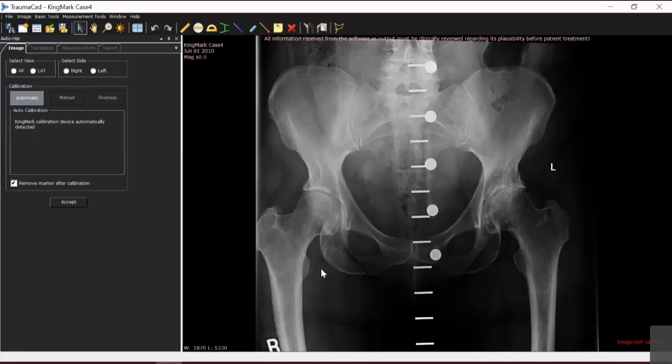Also in that case, once again, this goes back to radiographic practice. If there is a pre-existing leg length discrepancy, then blocks of the relevant size are placed under the affected leg so that you can get a true idea or understanding of where the deformity is arising from.